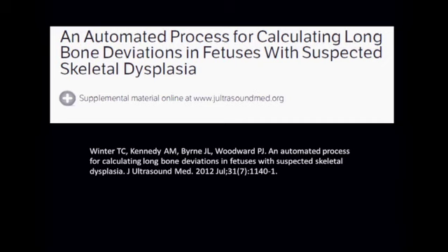One of the things about this whole math thing is there's an awful lot of busy work involved, and my colleague Dr. Winter, who was a math physics major before he did his medical school training, wrote a program that makes it very easy to do all of this measurement and calculation, and the link is in this journal article. And basically all you have to do is enter your measurement into this program, and then it will calculate all the math for you with the number of standard deviations below the mean that all of the individual bones are.